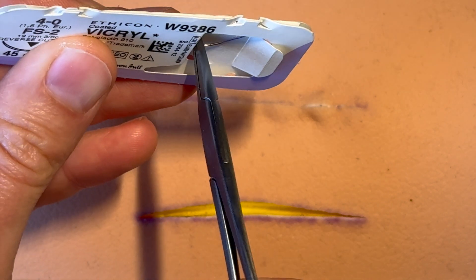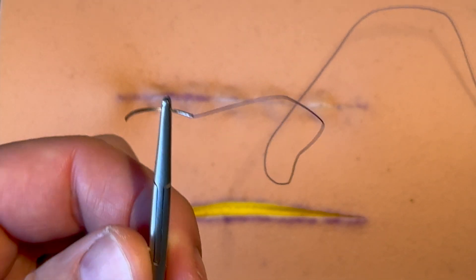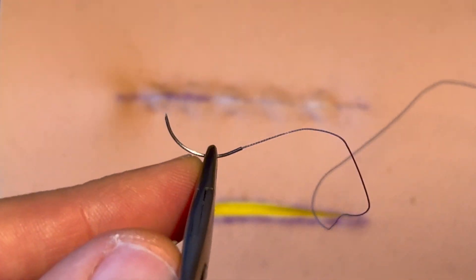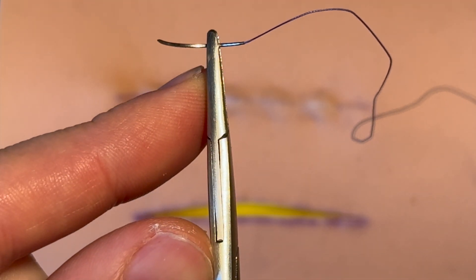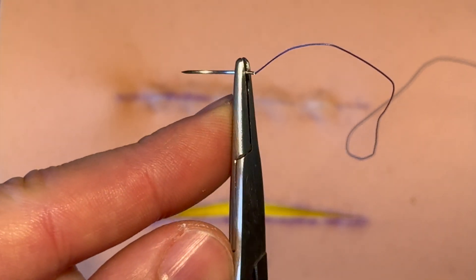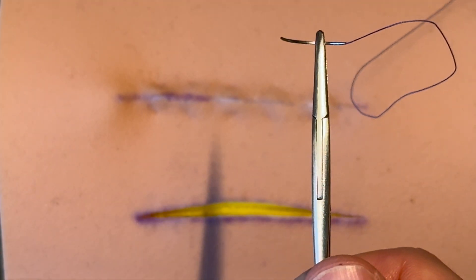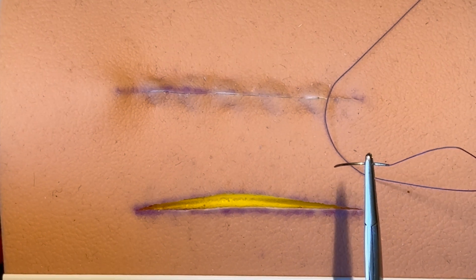The needle is nicely presented with the thread ready for us to grip with our needle holder or needle driver. Grab it about a third or so along the needle curvature, so that you're not grabbing the bit where the thread inserts — otherwise that's going to uncrimp it and the thread's going to fall off eventually. Grab it on that flat surface, sticking out from the needle holder like this if you're right-handed.